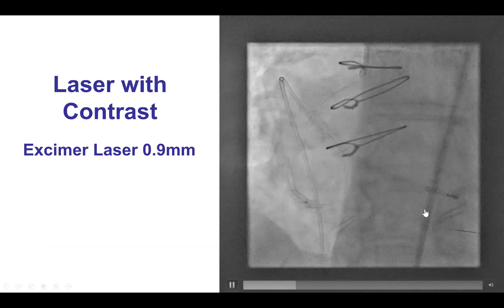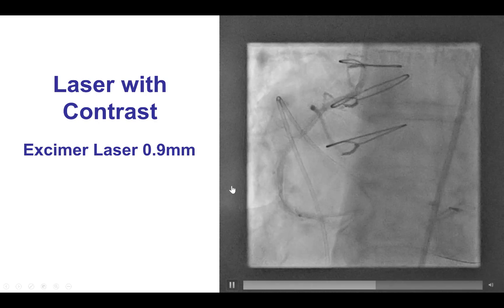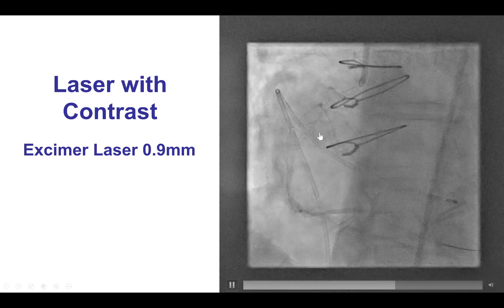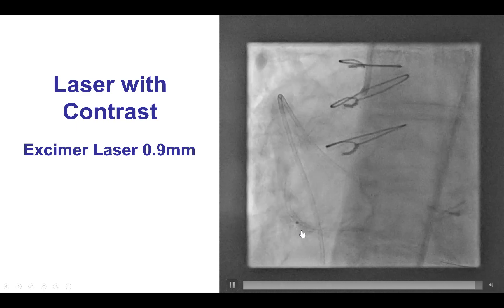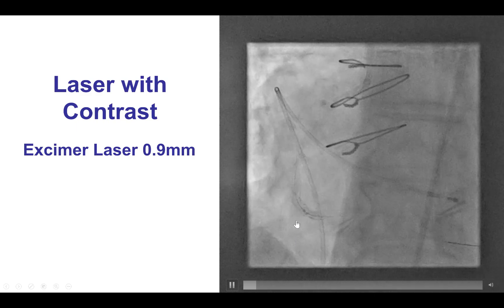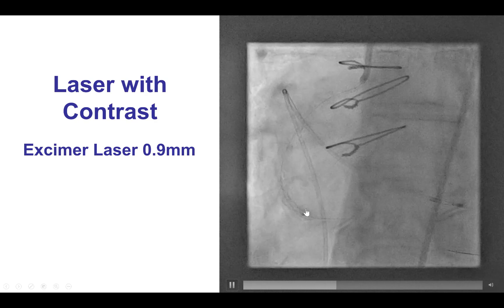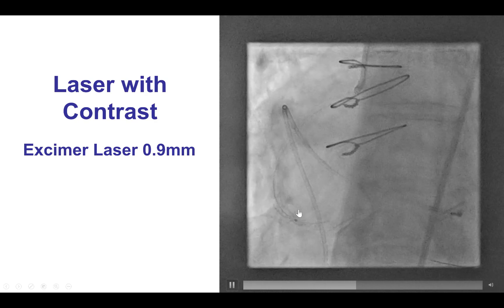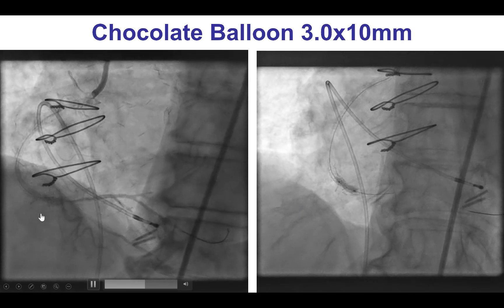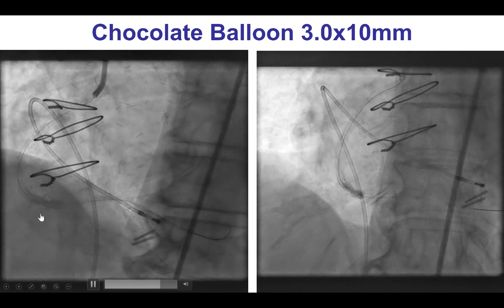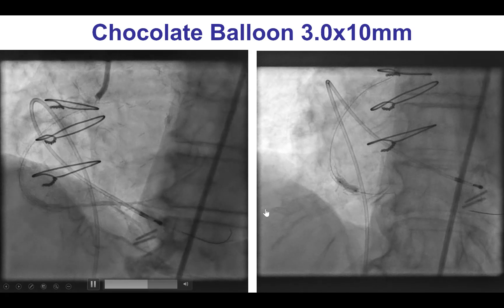After atherectomy did not work, we decided to do laser. This is laser with contrast — a 0.9 mm laser activated with simultaneous contrast injection, which causes an acoustico-mechanical effect that can modify the plaque and help expand the lesion. Unfortunately, it did not work. There remained a waist and under expansion on intravascular ultrasound.